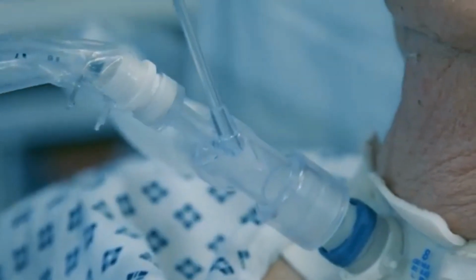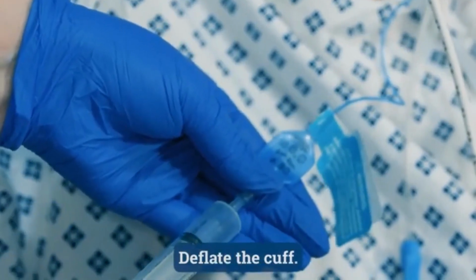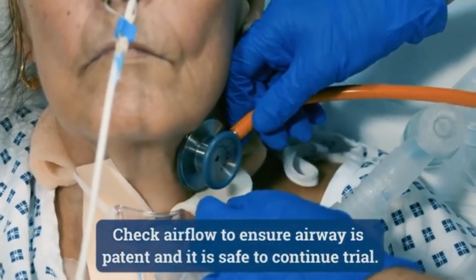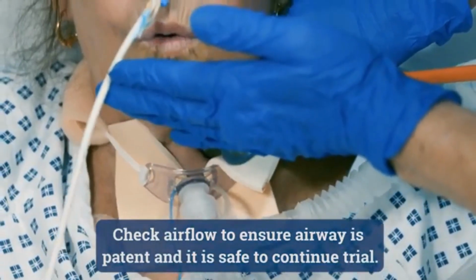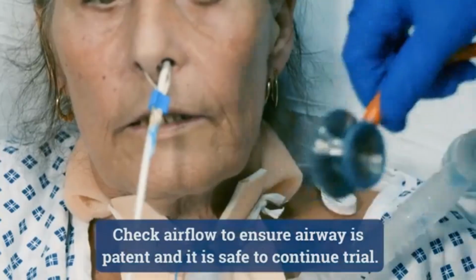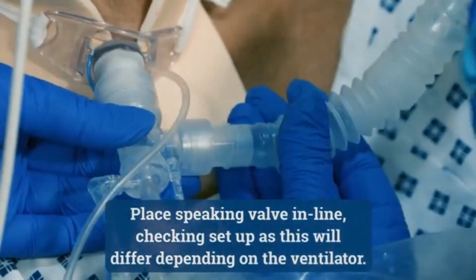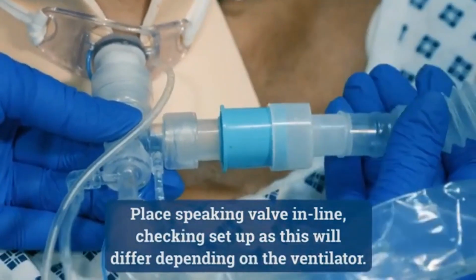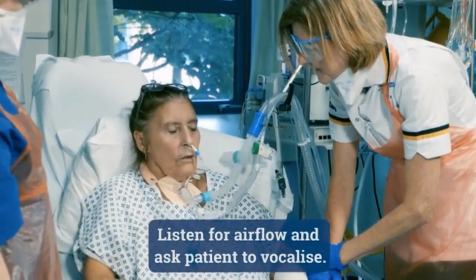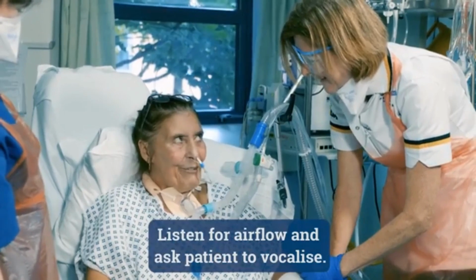The most important thing is to make sure that this cuff is down. It feels deflated, but we always check by taking any leftover air, any residual air out of the cuff. Then we're going to have a little listen to make sure that there's air moving past the tube. So Tammy, I want you to blow for me, and can you count to 3? Can you say the same again, Tammy? 1, 2, 3, 4, 5. Okay, hello. Hello. Got a voice.